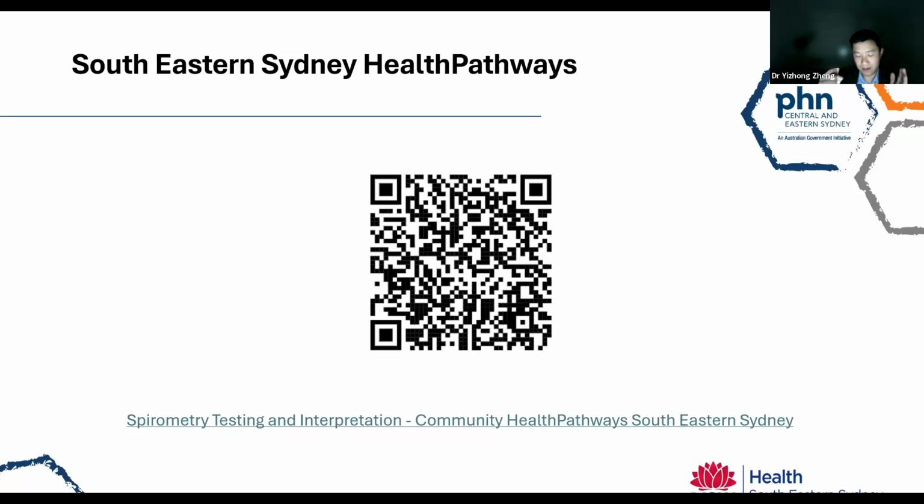If you do have a value where the patient is well, that would be your goal in future, but also appreciating with age, you have age-related decline in the FEV1 to FVC ratio, and you have age-related decline in FEV1. And I didn't bring it up, but it's controversial what counts as a significant change over time. 3 months versus a year, different patients, different ethnicity, different disease process, and we don't know.